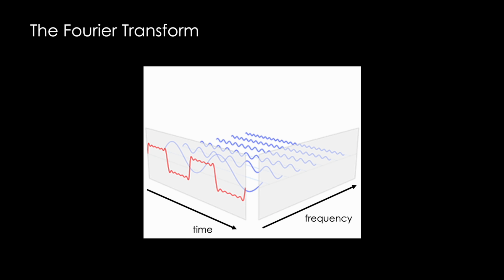One last thing to point out here. This process is bidirectional. We can do what is called a forward Fourier transform, where we go from this original function, our raw signal in our MRI physics example, into the simple waves that make up that function. We can also do the reverse. If for some reason we have a collection of simple sine waves, we can perform an inverse Fourier transform where we add these together, recreating our original function. This is a lossless process. We can go forward and back, however many times we like without losing information.